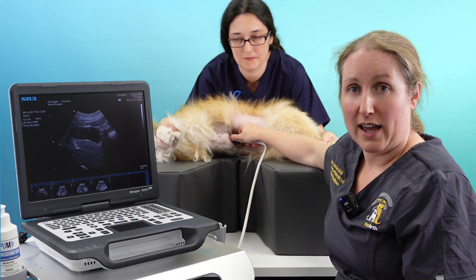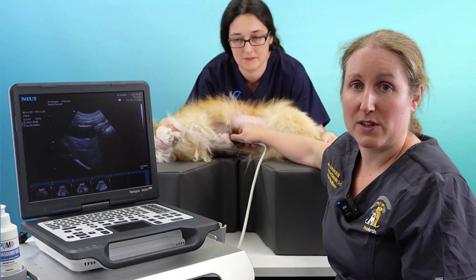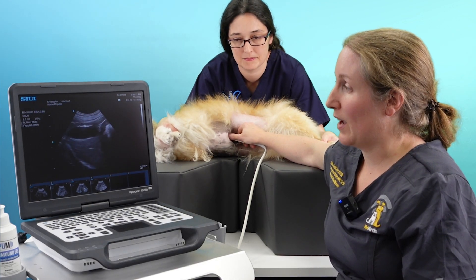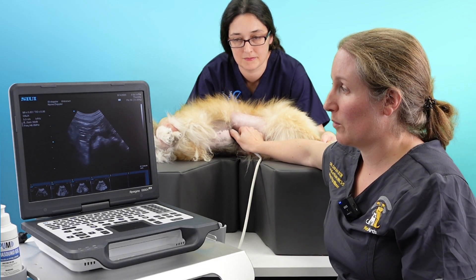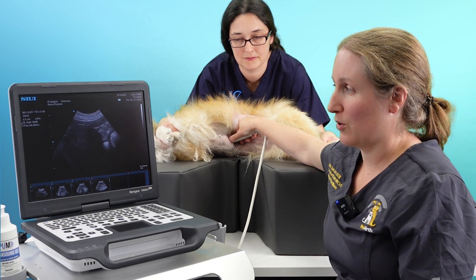When scanning any organ, we want to make sure we've covered and viewed all aspects of it, so we're going to need to do some fanning. We'll fan up so we're off the organ, and then fan down so we're off the organ the other way.